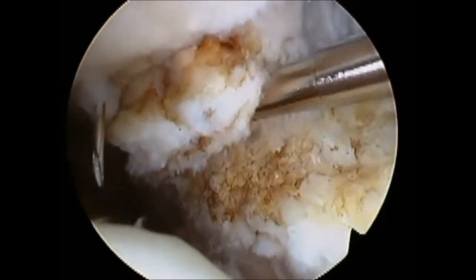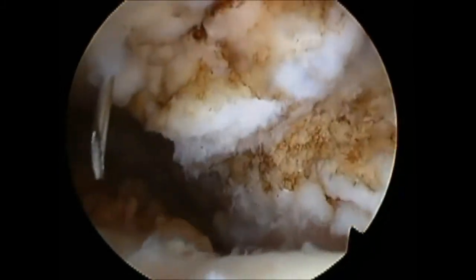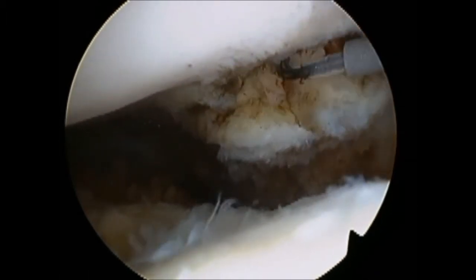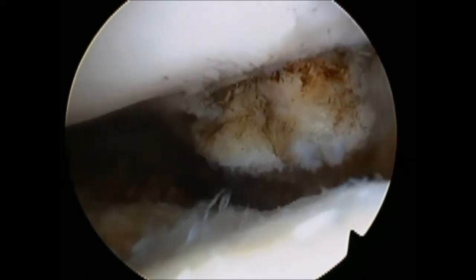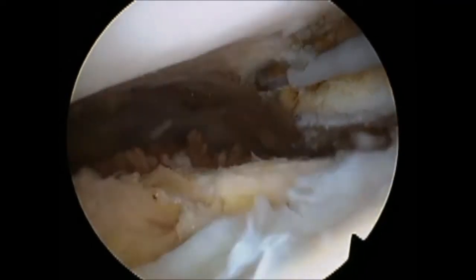This part of the procedure is performed with the combination of a soft tissue shaver, radiofrequency device and elevator to shell out the fragment without causing iatrogenic injury to the patella retinaculum or vastus lateralis attachment. It's important to do this to avoid dysfunctioning the extensor mechanism and also to preserve the blood supply to the patella body.